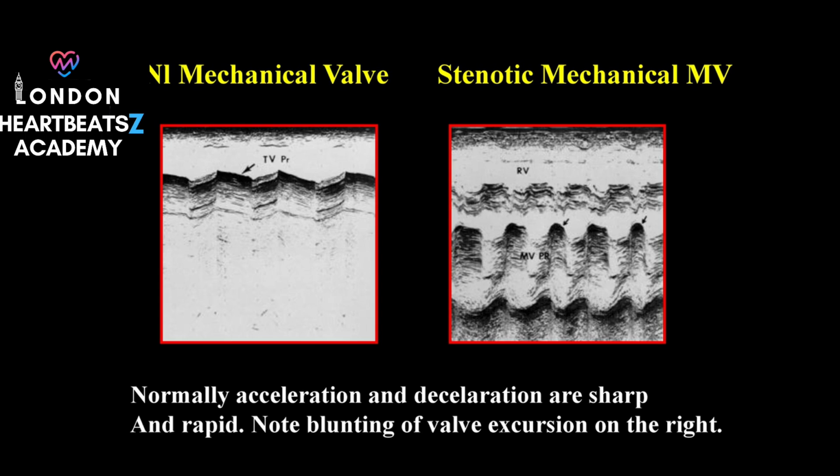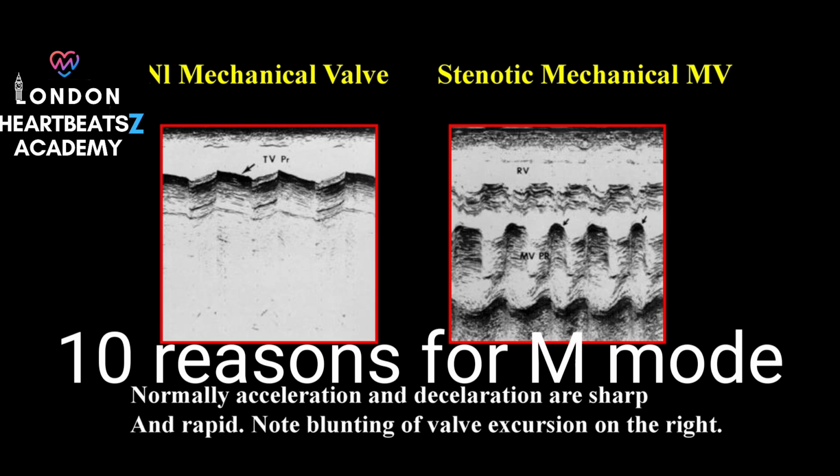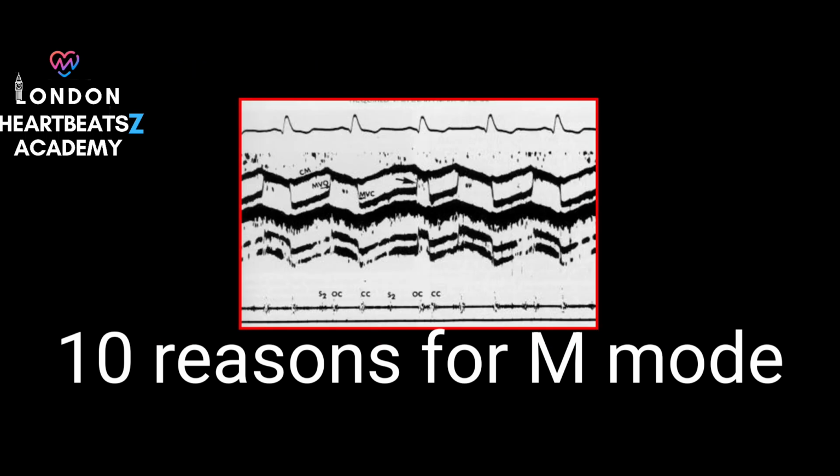Our sources actually listed 10 key reasons to love M-mode. Some of those intriguing benefits include its ability to provide a clear understanding of left atrial hemodynamics, easily evaluate synchrony, identify high-frequency motion that other methods might miss, evaluate pulmonary hypertension, even without tricuspid or pulmonic regurgitation, and offer insight into the mechanisms of pulsus paradoxus and tamponade. This is an incredible list.